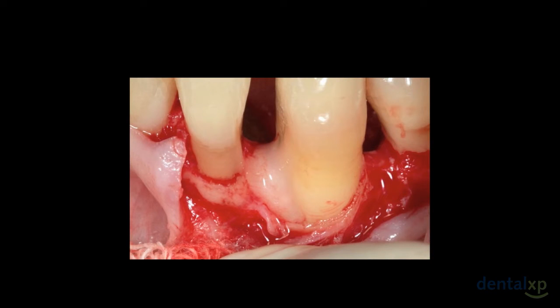Because this case is about 10 years old, at the time when Emdogain came out, it also came with Pref-Gel, which is EDTA. I had no problem using a Pref-Gel, nor do I do today. You need to place the Pref-Gel on the root surface for 2 minutes to help demineralize the root surface. Also, in my cases today, I tend to use phosphoric acid 40% for 25 seconds.